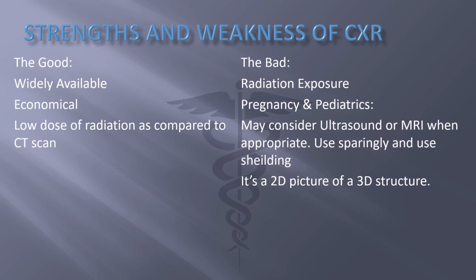So there are some good things and bad things about chest X-rays. Some of the good things, the strength of chest X-rays, is that it's widely available. You can go into an outpatient clinic and sometimes they'll have an X-ray machine there, urgent cares, things like this. Some rural clinics, some austere settings, such as third world countries, will have some X-ray machinery that they can take pictures.